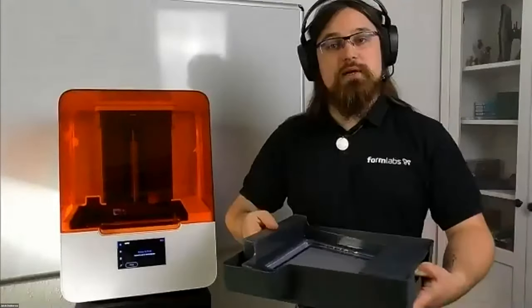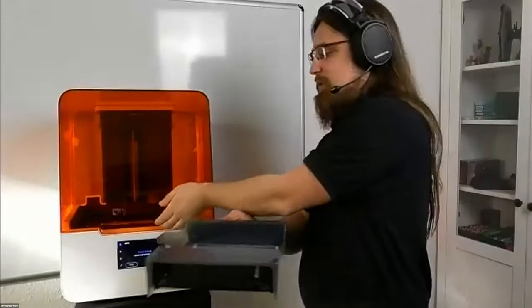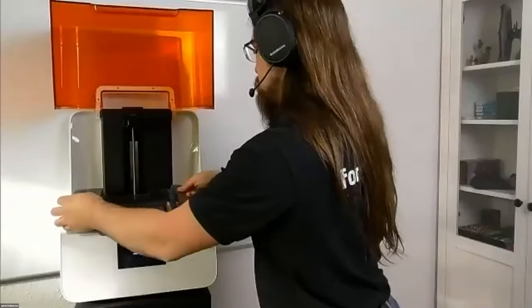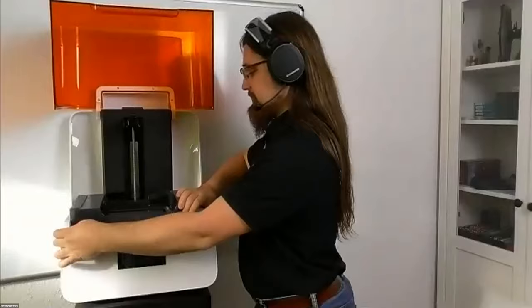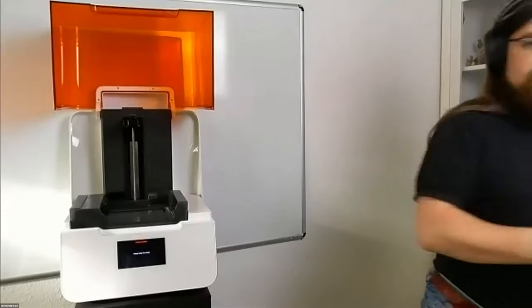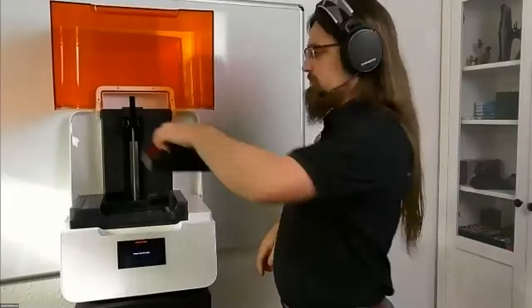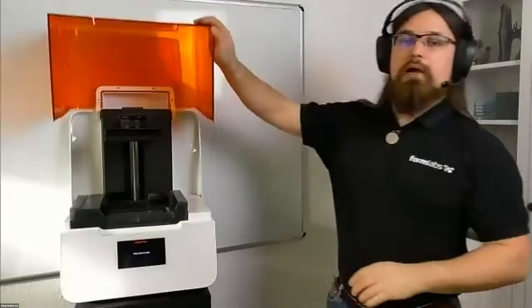And then basically all you do is you just need to take it out of the box, insert it into the printer at the bottom. And then when it's nicely inserted, you will also hear a little beeping sound from the printer that it has detected that there is a tank now in the printer itself. You will need a build platform. And this also just goes in at the top here. You just open up the lever at the top, slide it in and close the arm again.